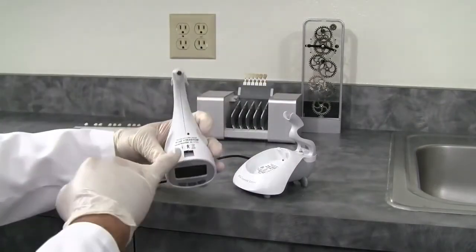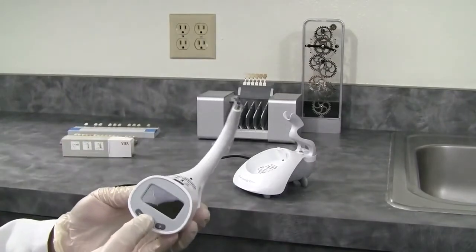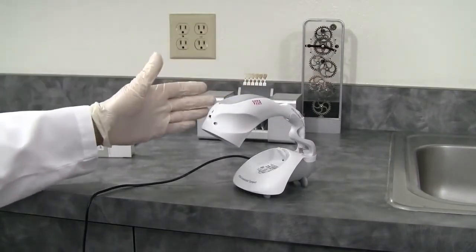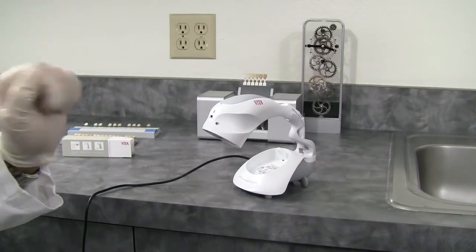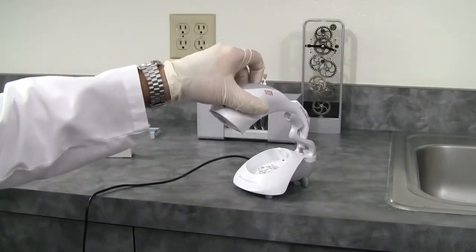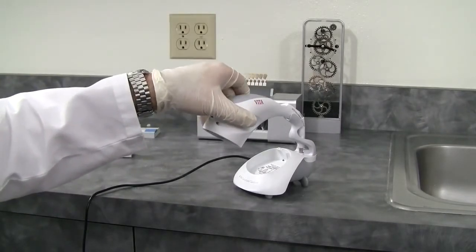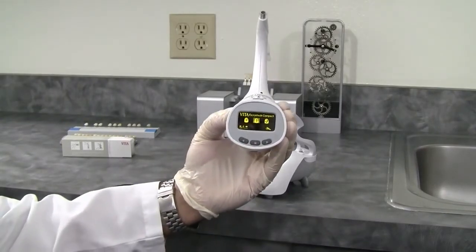Take the unit out of the power holder and press any button to turn the machine on. You can see the animation is telling you to calibrate. Simply place the whole unit into the holder and push the unit forward — you don't touch any buttons in this automatic method. Underneath the calibration block is an electronic switch. At any time you can recalibrate in automatic mode by putting it in and pushing slightly forward or pushing down, which will automatically calibrate the device. It will always return to the last shade taken, and we were using it in the tooth areas mode.